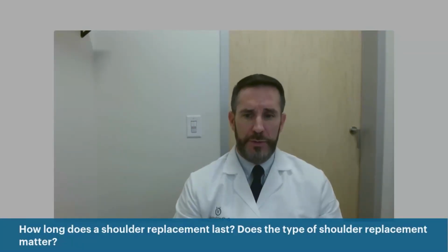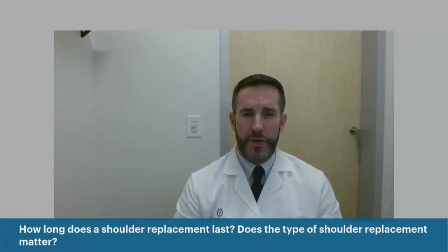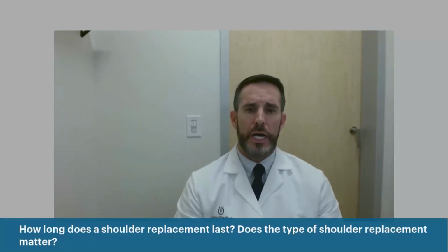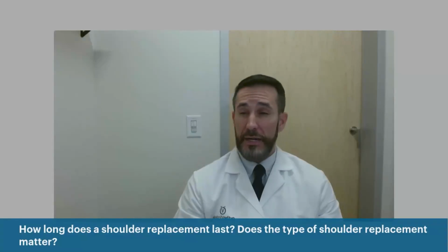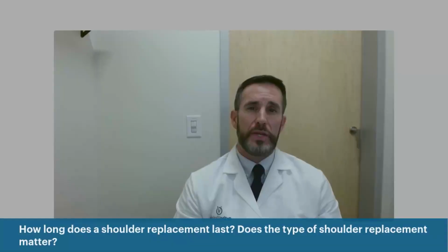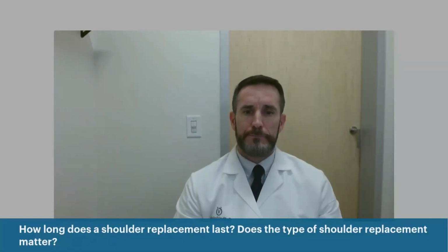And even in the reverse replacement scenario, the materials and bone ingrowth on both the humeral and base plate side have come a long way. So the bone ingrows into these implants in a way that I think is better than it was historically. And plus, with the ability to correct deformity and have the best fixation at time zero, reverse replacements can do extremely well long-term. So that would be my answer to that.